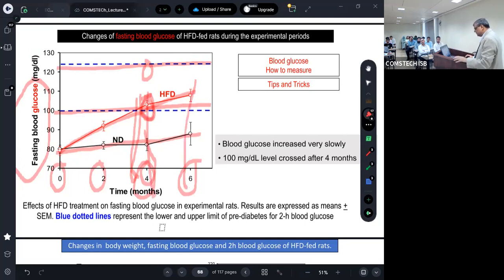How are we taking the fasting glucose of these rats? They are on a high fat diet, so are we making them fast as well? Yes. There are 2 options. Many people come early morning to the laboratory, at 8 or 9, remove the food, and measure before leaving.